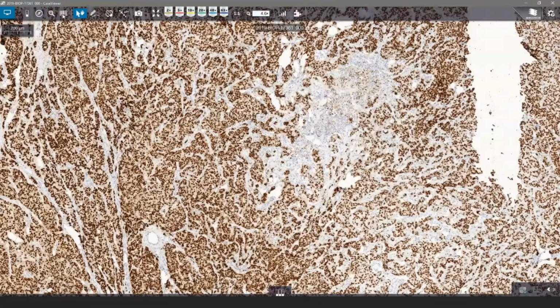You can open the label area as well. The label area can be rotated if needed. You can read it basically in any case.